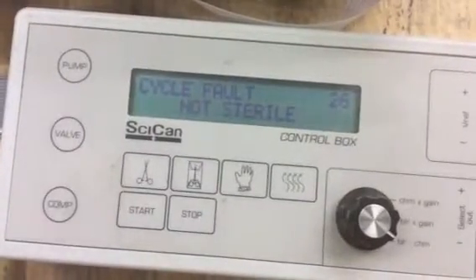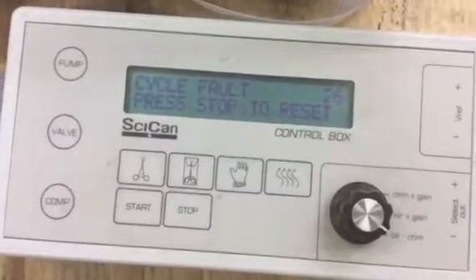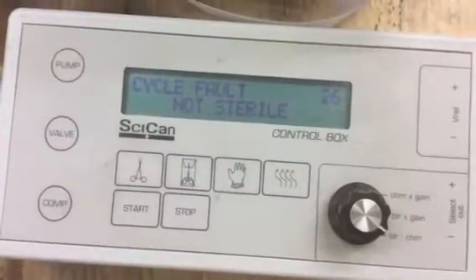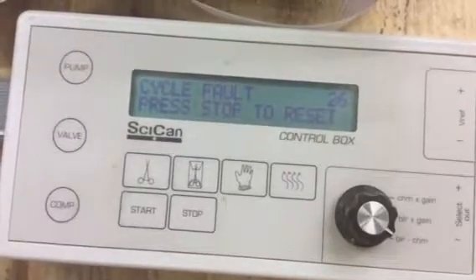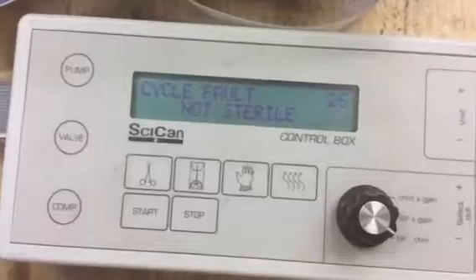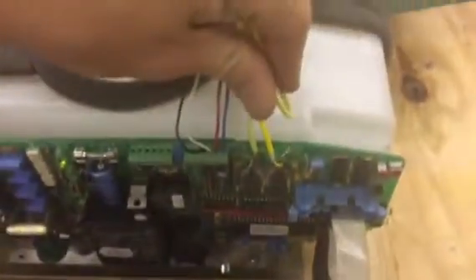Sterilizer Autoclave Solutions, Charlotte, North Carolina. 704-966-1650. We have a Statum 2000 recording cycle fault 26. Basically what that means is the thermocouplers can't agree on the temperature.